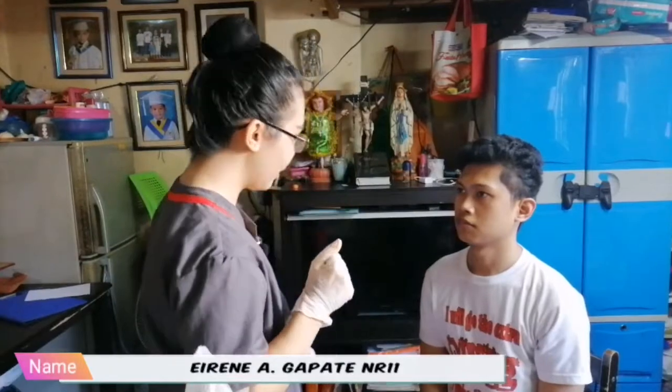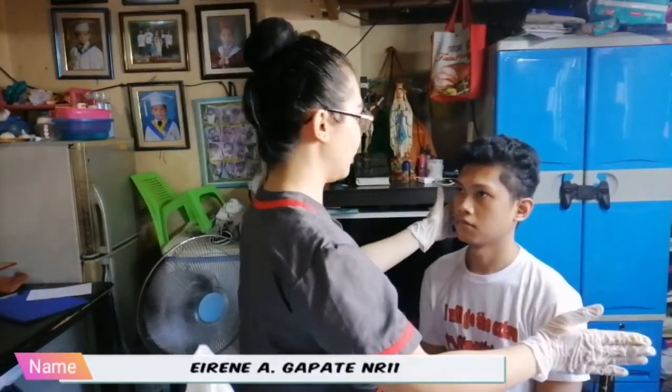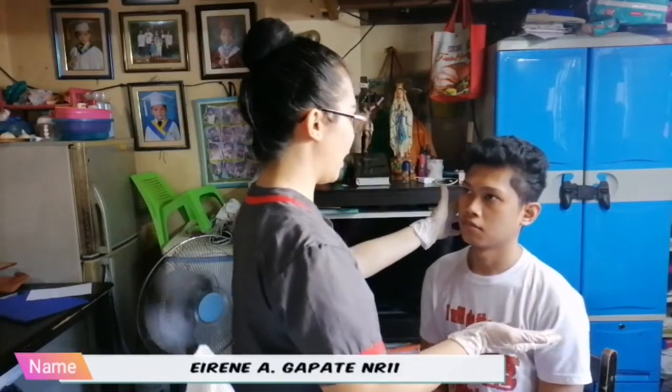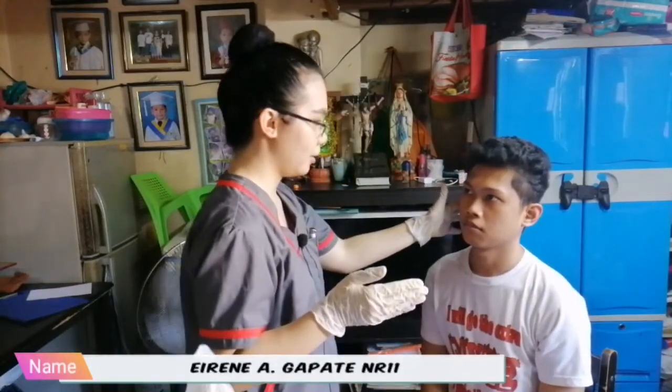Now, perform an otoscopic examination of the tympanic membrane to assess any abnormalities within that area. Now, I will assess the patient for hearing acuity, which tests cranial nerve eight. So, let's begin the test for the whisper test or voice test to assess high-frequency hearing. So, sir, i-occlude natin yung isang tenga nyo. Then, bubulong ako dito sa hindi naka-occlude na tenga. Tapos, gusto ko ulitin nyo yung ibubulong ko if narinig nyo, okay?